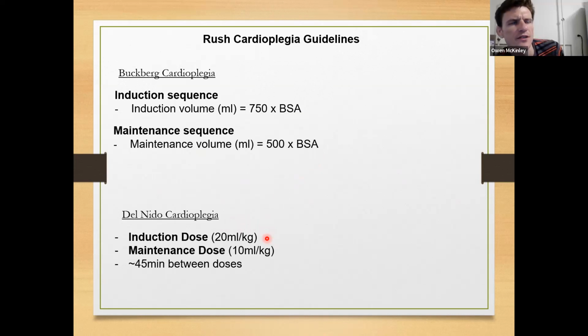Can it be around 75 minutes? Yeah, I would say that would be a higher end of where you're targeting. Where I work, around the 50-minute period is when we redose, if need be, especially if we're not going to be taking the cross clamp off anytime soon. But you can safely go above an hour, which is pretty impressive.